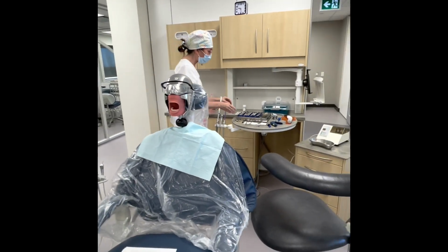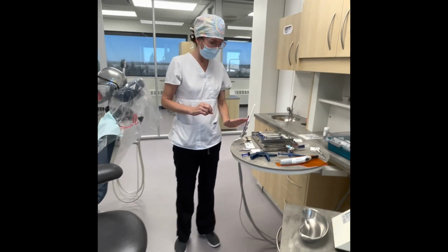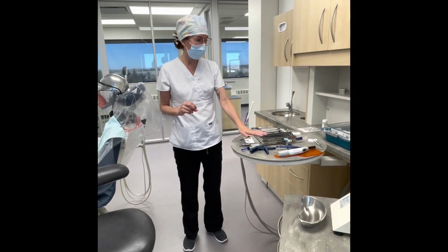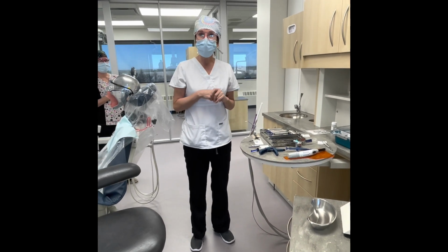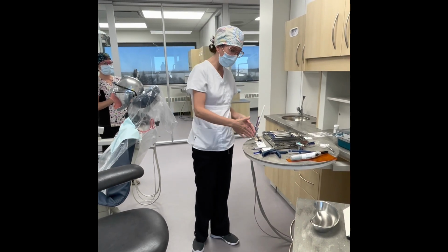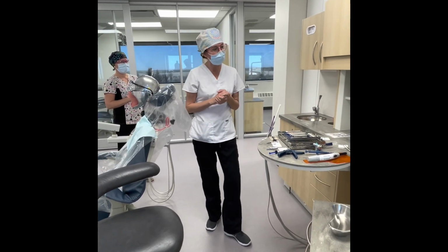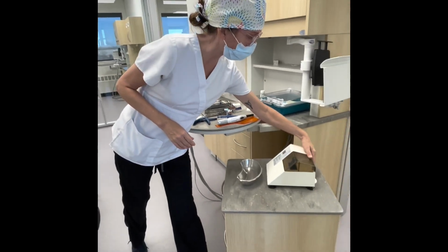Over here I have my restorative tray set up. I have my banding system, my bonding system, and then my composite and amalgam, which I will use for the fillings, okay? I like to go from left to right: band, bond, fill. Keep things organized for yourself. I also have my curing light out. I'm going to make sure I turn on my amalgamator.